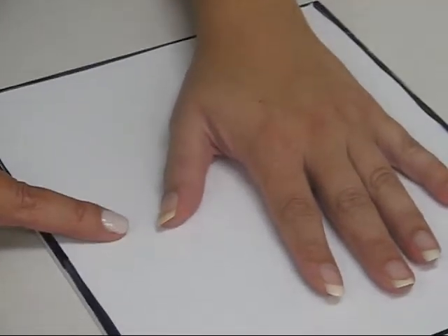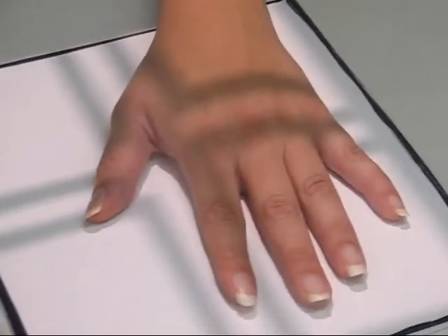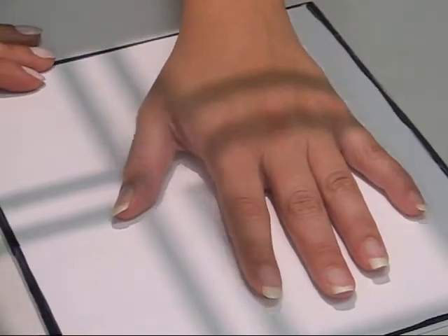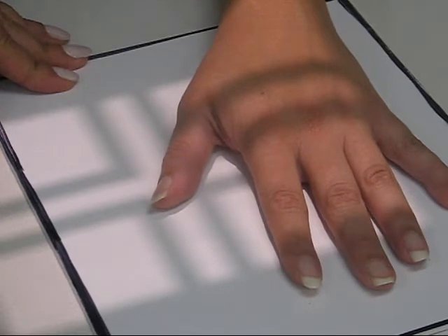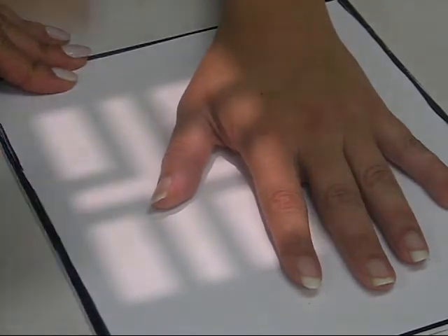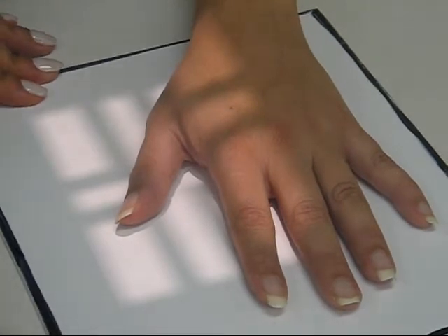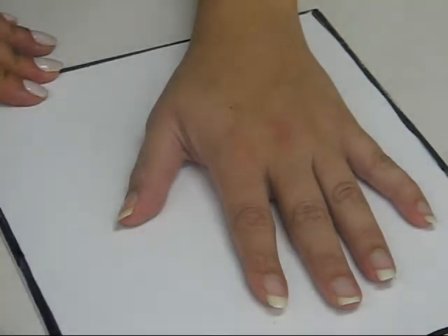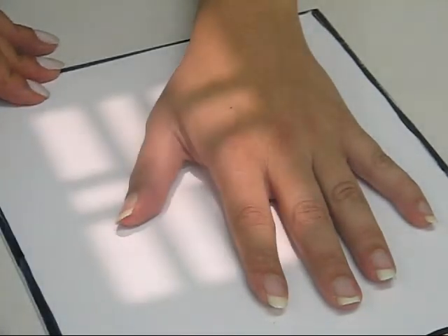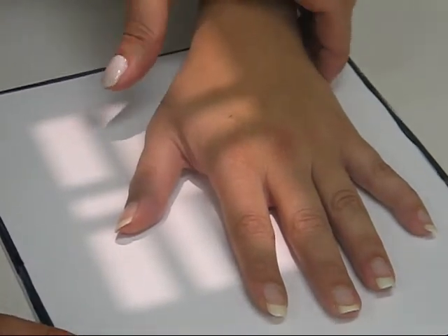So if you want to do an oblique of the thumb, you basically put your hand in a PA position. And again, you can collimate solely through the thumb if you want to isolate it from the rest of the hand, or if you're doing the entire hand, that gives you the oblique position of the thumb.